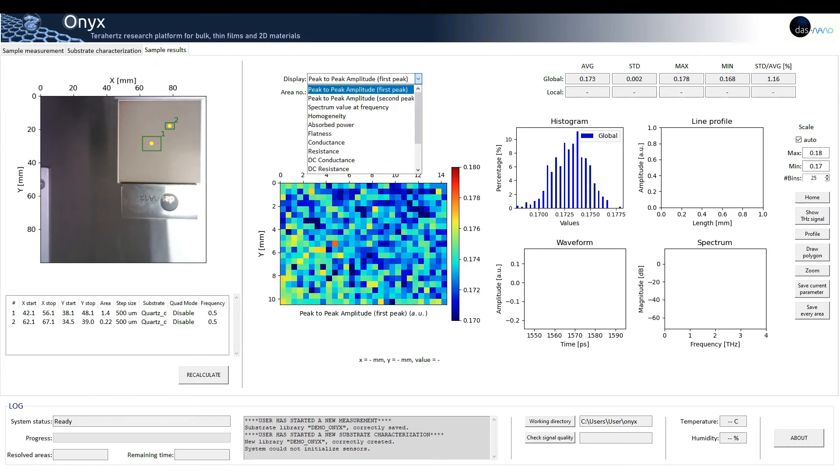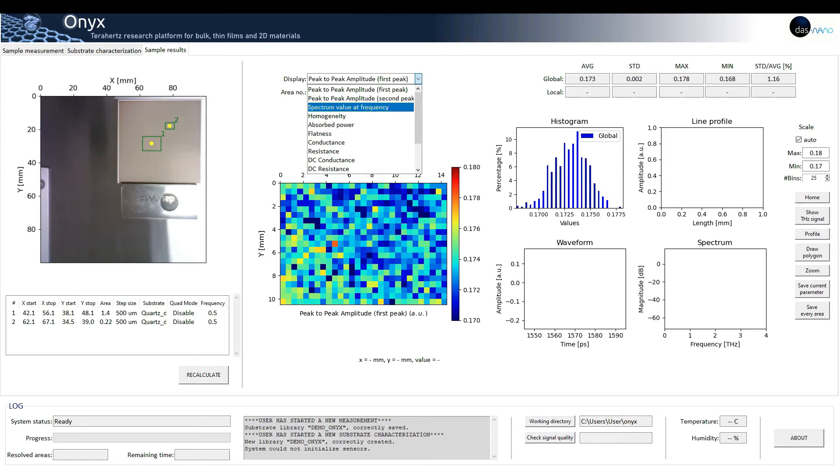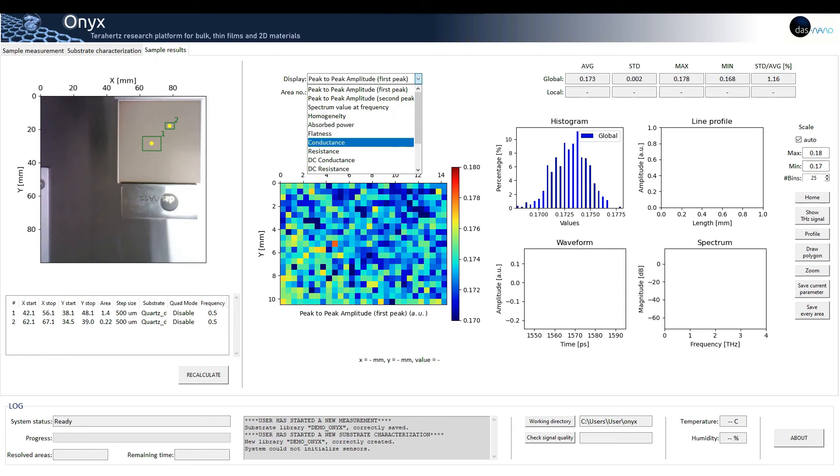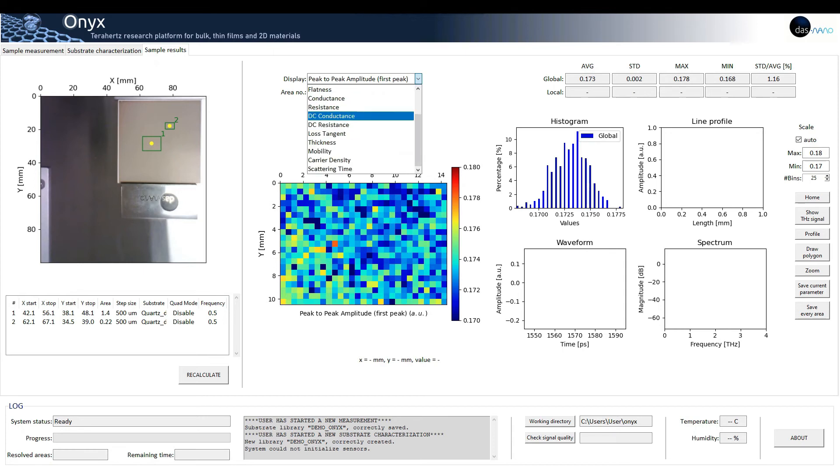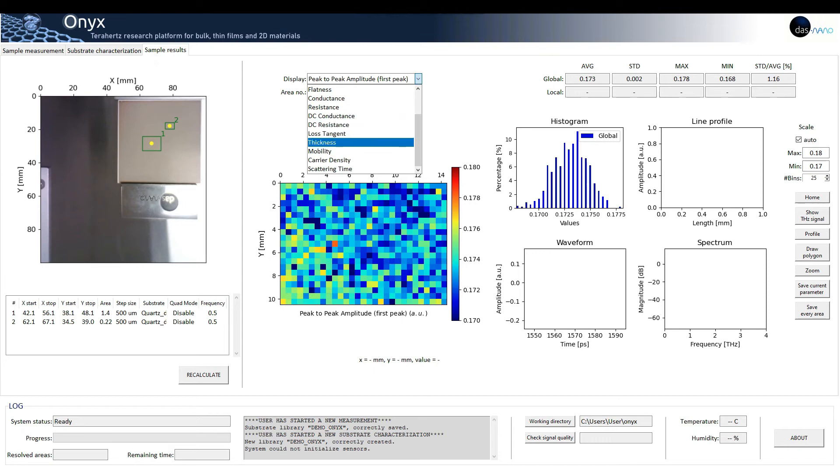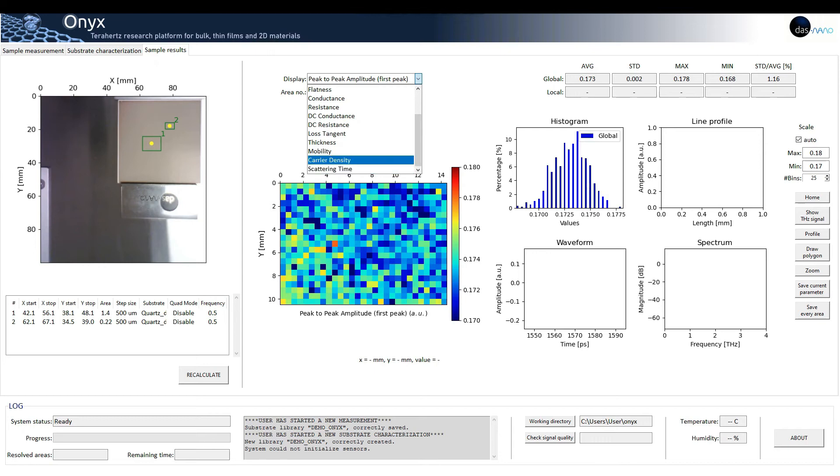Peak-to-peak amplitude of the first and second peak, spectrum value at a fixed frequency, homogeneity, absorbed power, flatness, conductance, resistance, DC conductance and DC resistance, loss tangent, thickness, mobility, carrier density and scattering time.